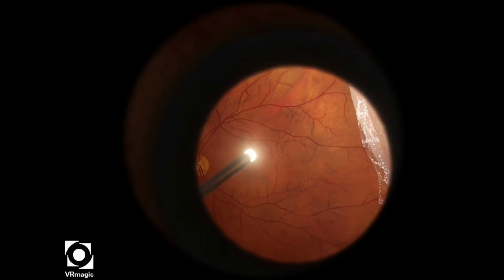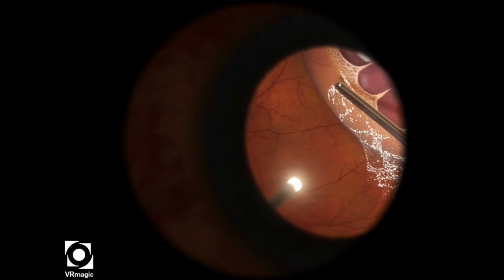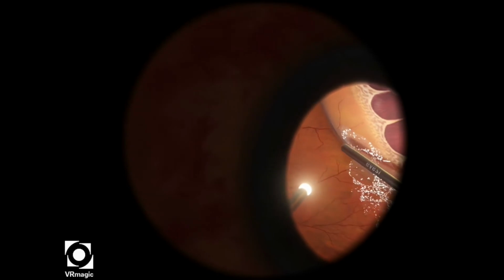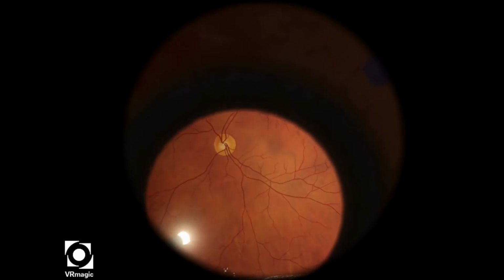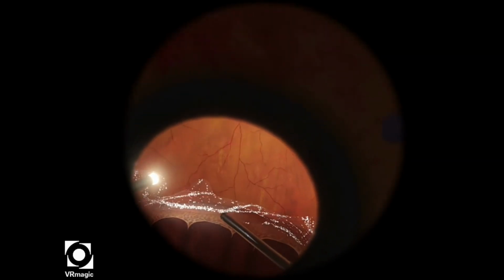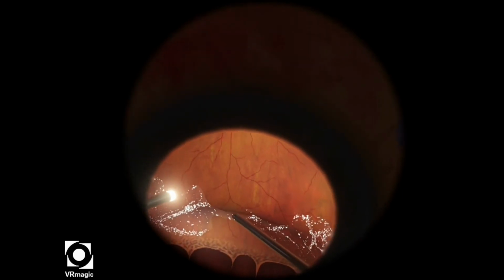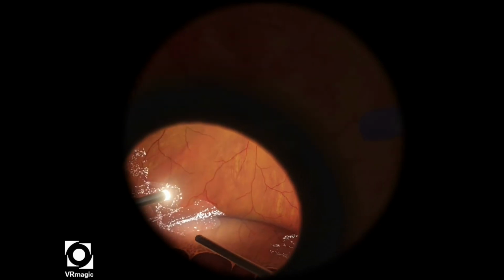Again, trying to go to the peripheral retina. Here you've got to be careful because if you reach across directly with your left hand with the vitreous cutter, you will inadvertently ding the lens. So just try to reverse the cutter using your right hand and you'll be able to get some of that vitreous, just like I'm doing here. Again, no aspiration to low aspiration and a very high cut rate. That's the safest way to approach these areas of peripheral vitreous, which is very challenging.